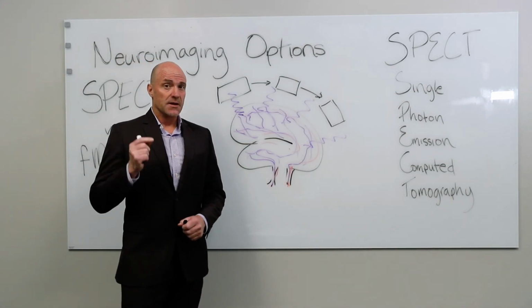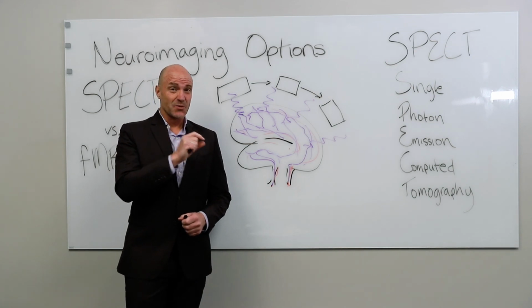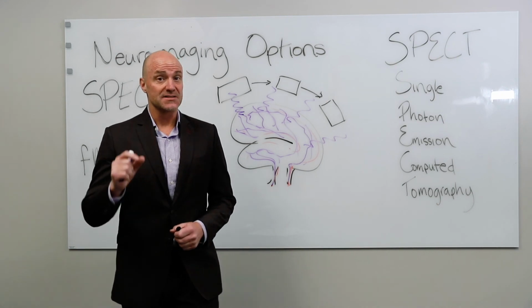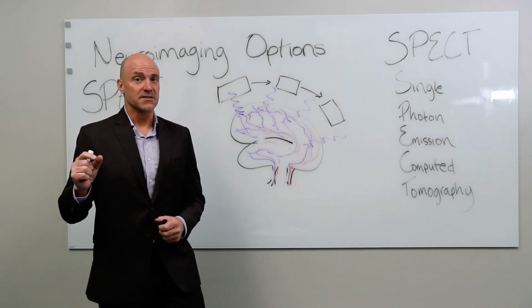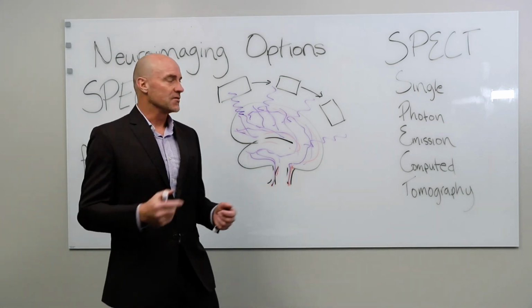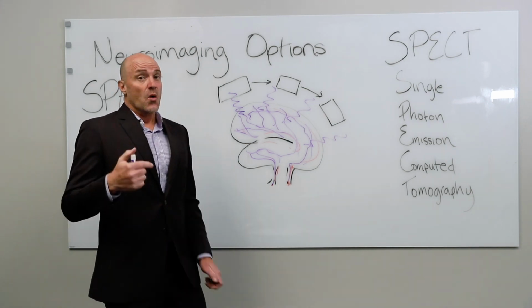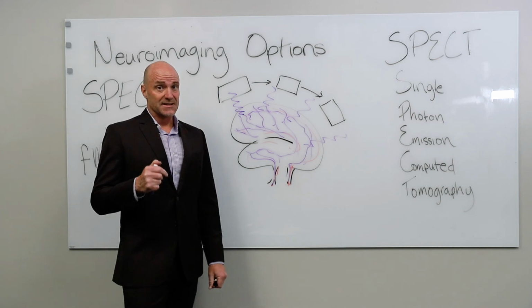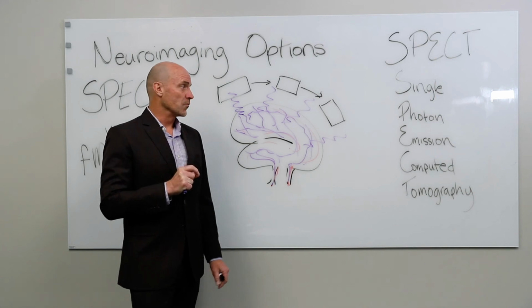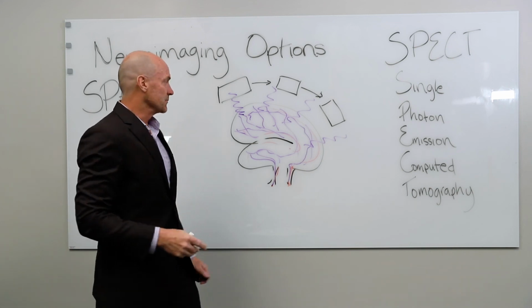As I talked about, in concussion assessment and treatment, we're interested in specific brain regions and the cognitive tasks that those brain regions do, because this could be selectively damaged in concussion. You have some brain regions that are working great, others that aren't. And that's just kind of the way the pathology works. And so in an imaging sense, what we're really interested in concussion treatment is getting at these discrete, smaller brain regions, rather than just looking at the overall, how well the whole brain is behaving in terms of blood flow.